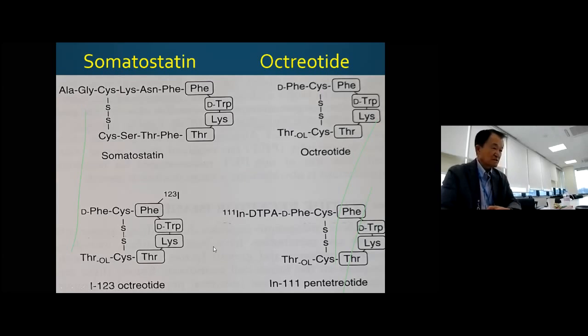Any tumor imaging requires a hybrid imaging system, because SPECT/CT or MRI makes precise localization and then characterization of the abnormality based on morphological CT or MRI. And then you may have additional information from CT, MRI, such as detection of tiny 1-2 millimeter size metastases, etc.